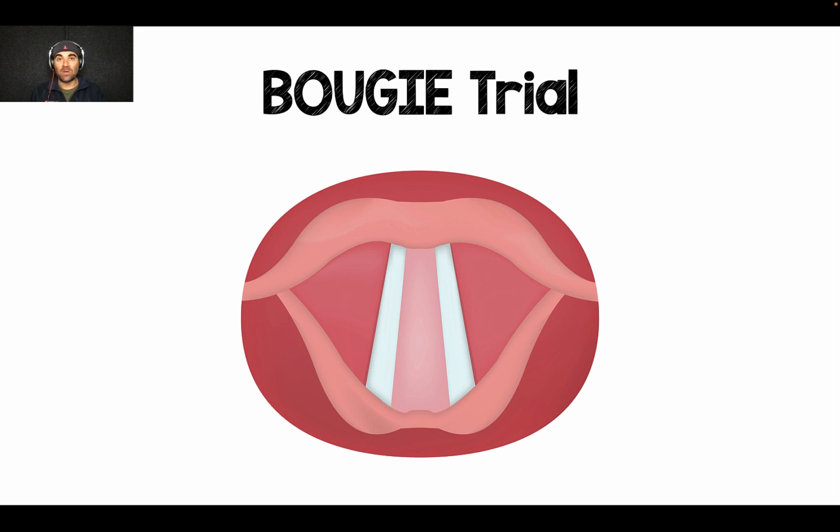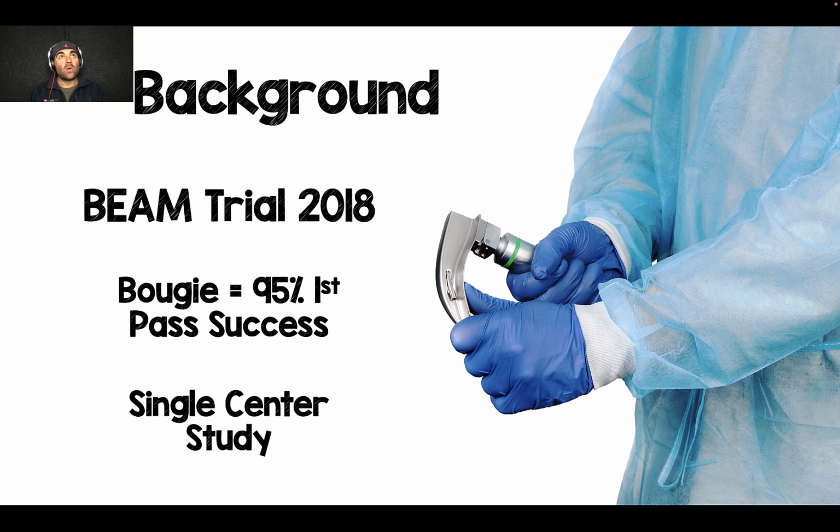And this time we're going to be talking about the BOUGIE randomized clinical trial. So, this was an interesting concept or shift for a lot of us in terms of changing how we manage airway. And it was with the publication of this single center study in 2018 called the BEAM trial. And what they found in this trial is that when you use a BOUGIE first and then feed your endotracheal tube versus an endotracheal tube with a stylet, your first pass success with the BOUGIE was 95%.